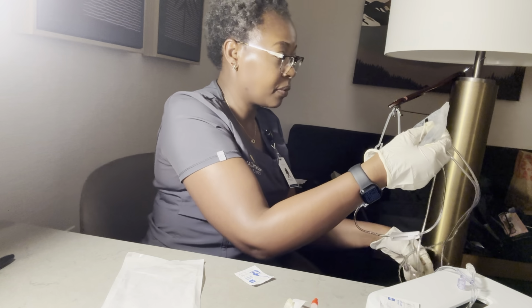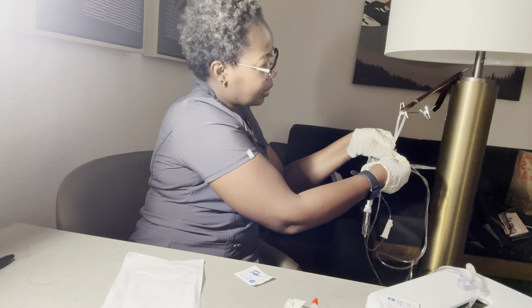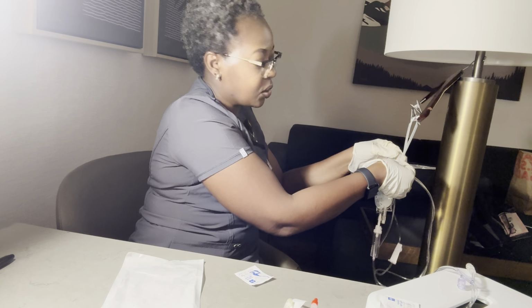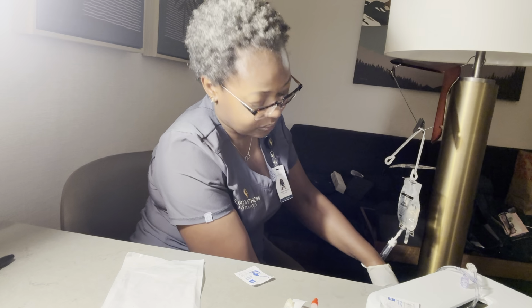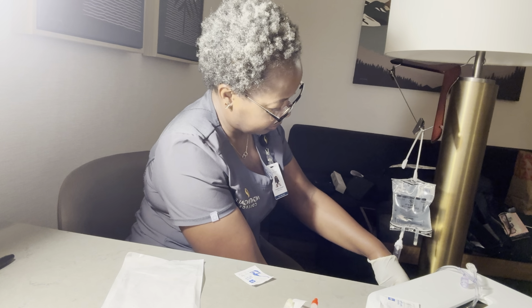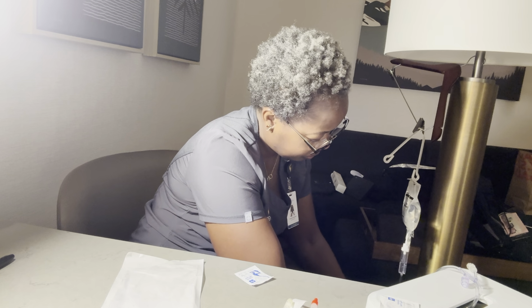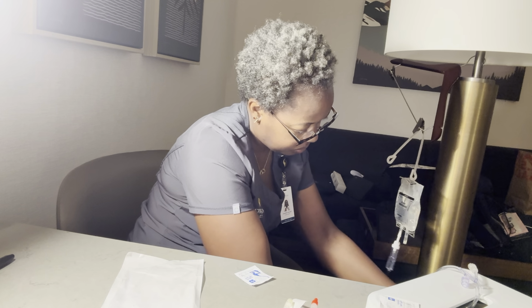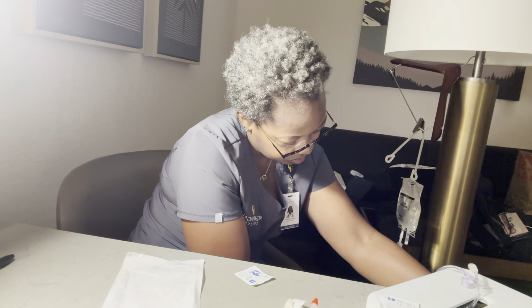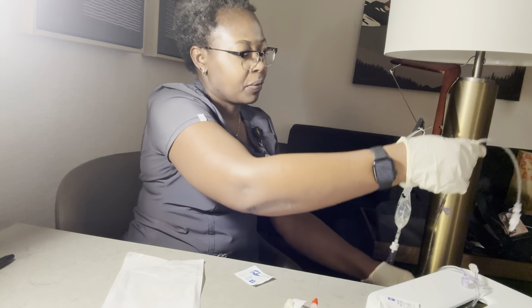And I have my roller up here, so I'm going to go ahead and hang this 30 inches above the IV site. And I'm going to have the primary line lower than the secondary line. Then I'll go ahead and prime the tubing. Then I'll go ahead and close it.